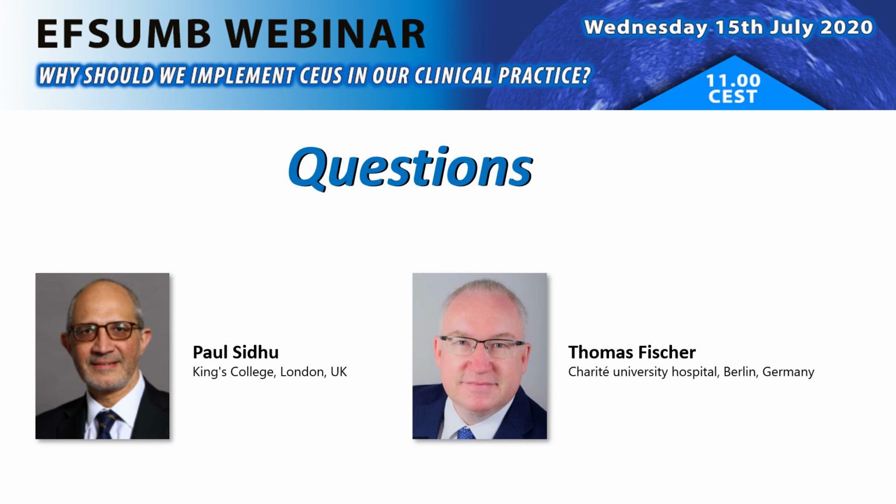What is your opinion? Yeah, in my opinion, yes, because it's very fast, it's safe, and of course we have to save also the scanner time on a CT scanner. So this is our, let me say, workhorse, and so it's much easier to use this in the ultrasound department to have this puncture procedure also in very severe cases where we use often this fusion procedure. So we have a clear switch between CT and ultrasound.